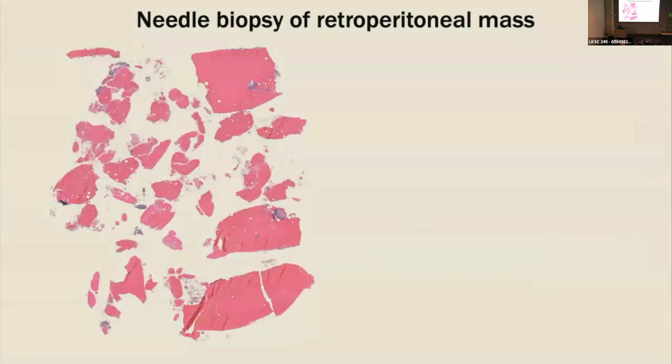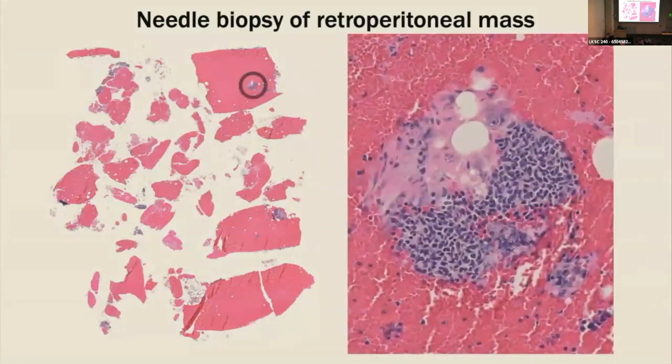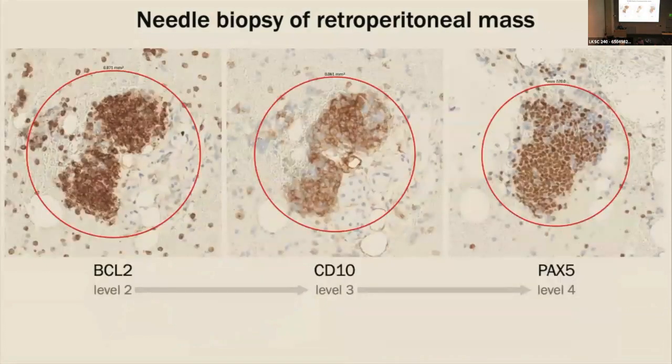This is a needle biopsy with a lot of blood, and then you have a tiny fragment of cells here. I thought it looked like follicular lymphoma. So these were the stains that we got. It's all 1-plex IHC. There's no co-registering individual cells from section to section.